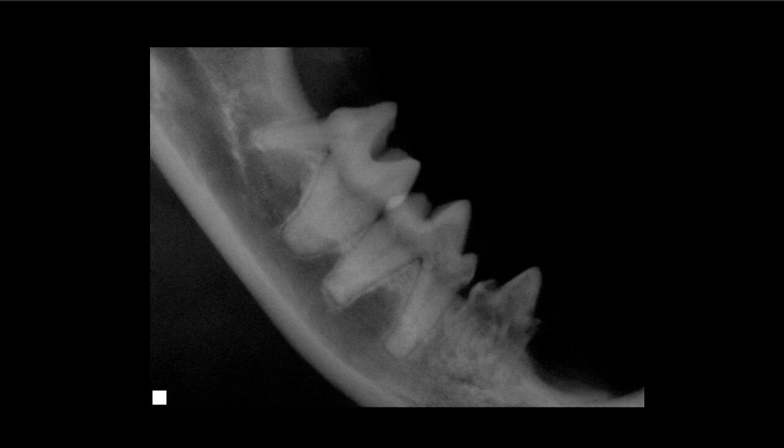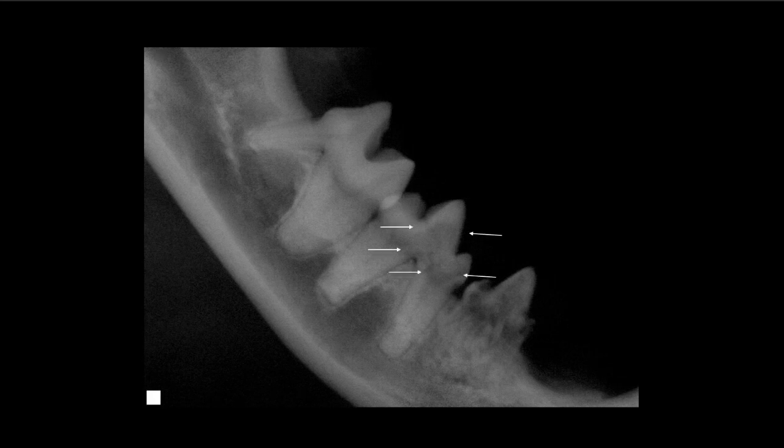and that's where the crown is involved with tooth resorption, which might not get picked up unless you're really looking at that closely. So you have to really closely evaluate that in order to make that determination. And so there's that area outline that I'm talking about.